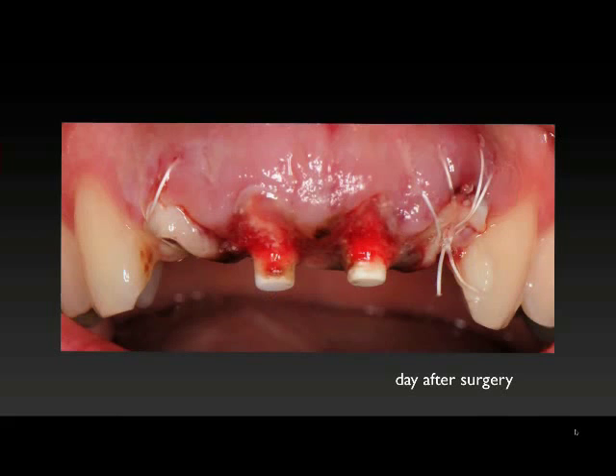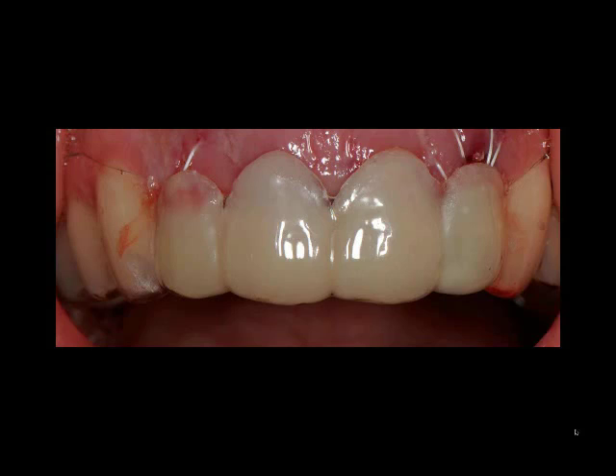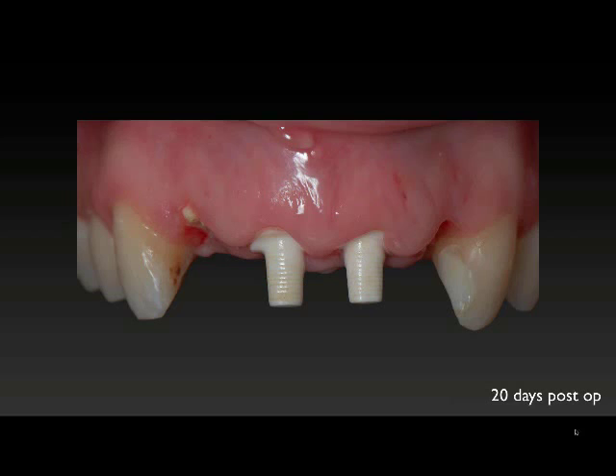This is a day after surgery — this is what everything looks like healing. The patient leaves with everything protected with a removable appliance with a little bit of composite on the facial. As healing progresses, we can see the tissues around these two implants are still very nicely maintained. You can see the papilla is still maintained, and you can see that the lateral incisor pontics are starting to take shape.